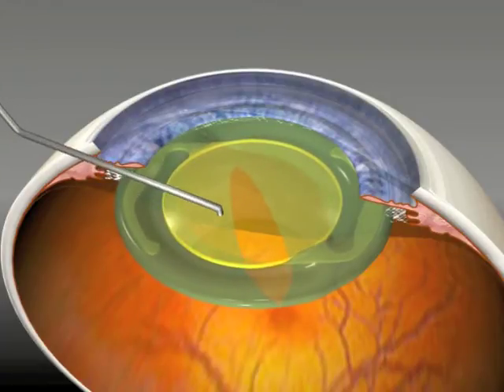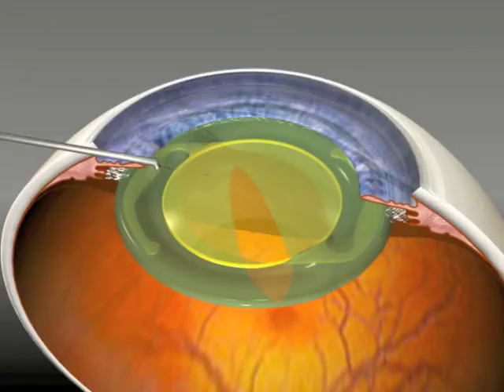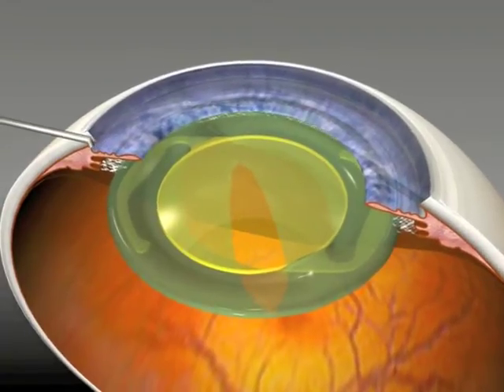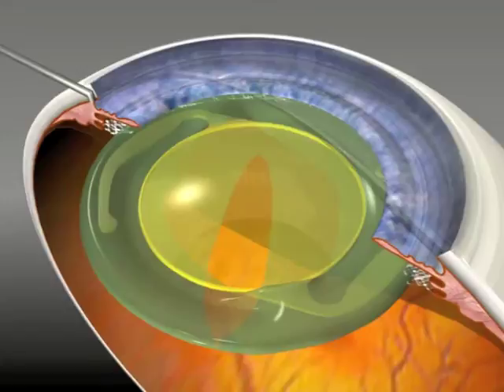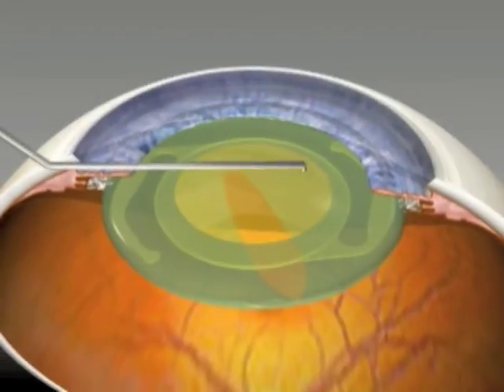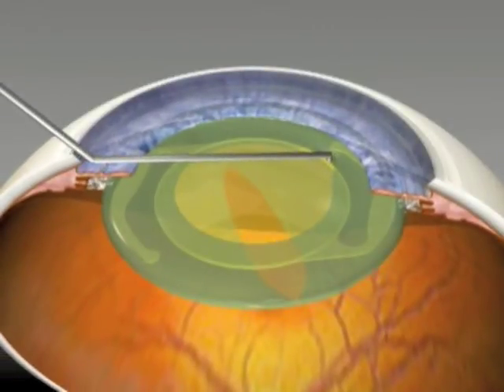Used in the event of posterior capsule tears but I've also used it to fixate toric IOLs in bags that are so large that the lens is unstable.